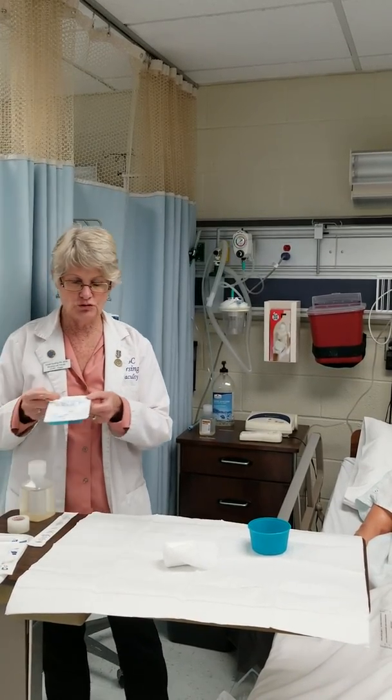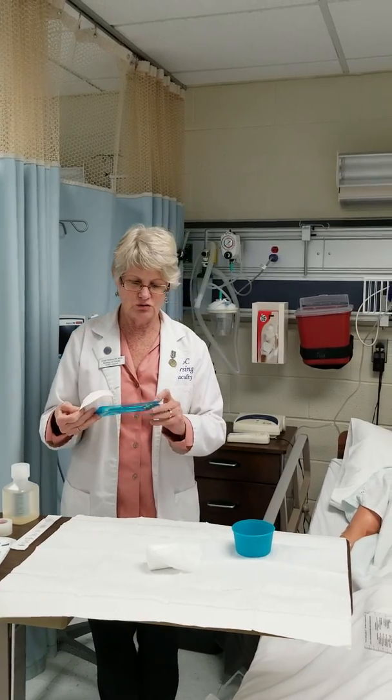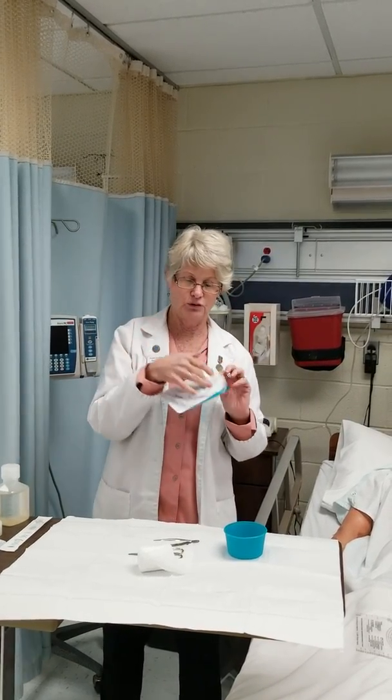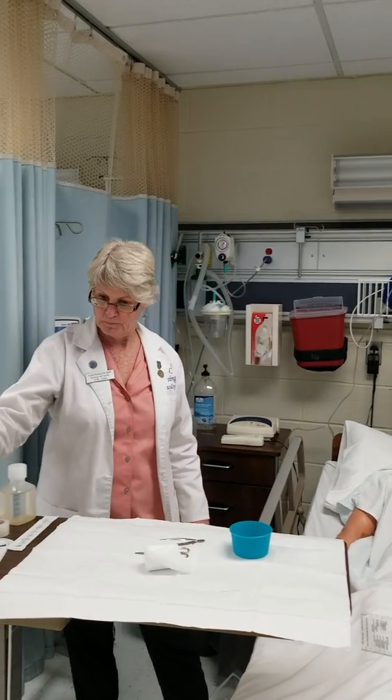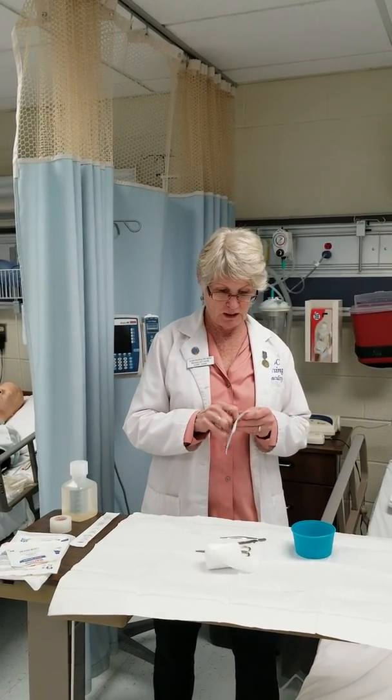You'll take your suture removal kit. Again, you'll peel the paper away, and then you will take this and drop your scissors and forceps onto your sterile field. Notice I do not turn my back on my field at any time. I always have to be aware and watching.